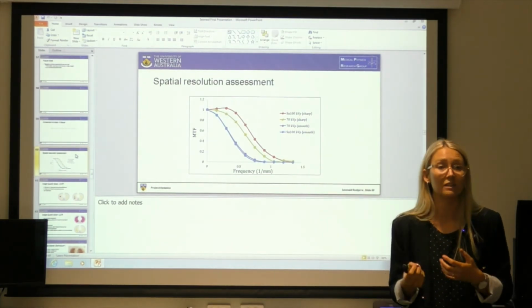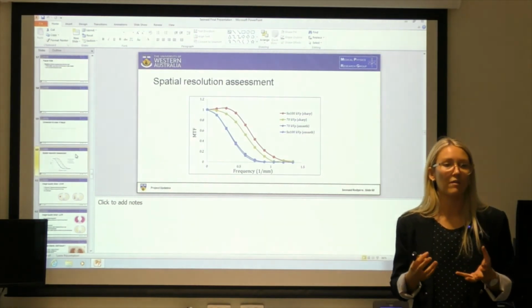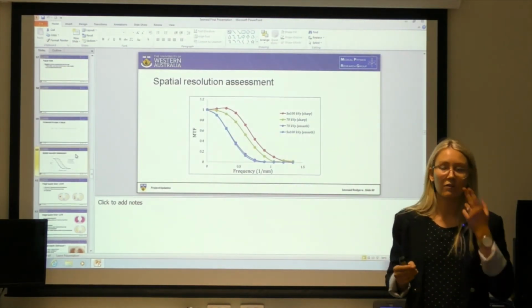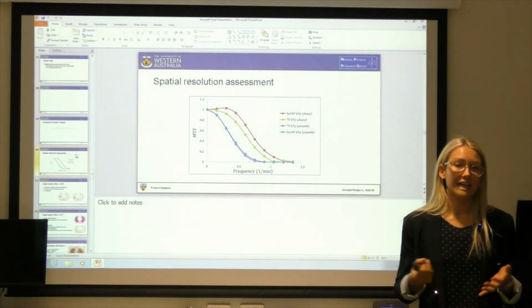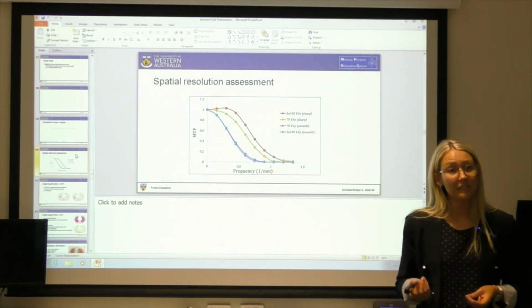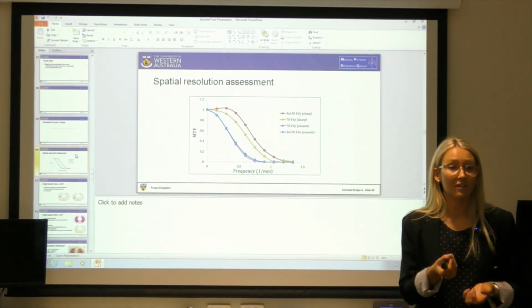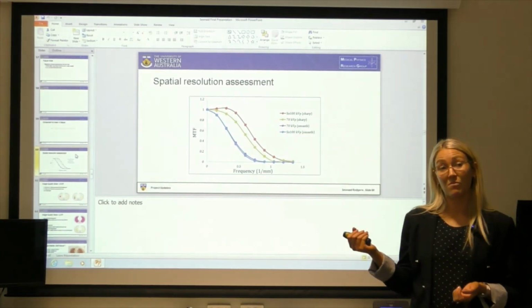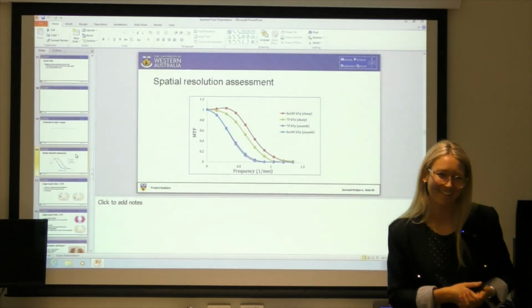The inherent noise in the cork was not appropriate for modelling the point spread function of the wire, so I had to use a different material, an EVA foam, which was a lot less noisy, and I was able to model the line spread function and get the MTF from the wire, and these are the results. So thank you for asking that question, Mario.